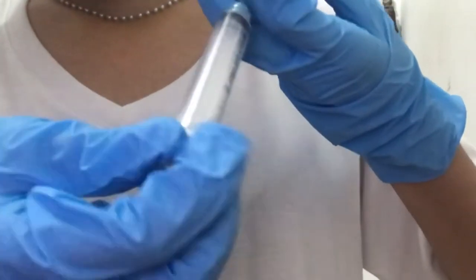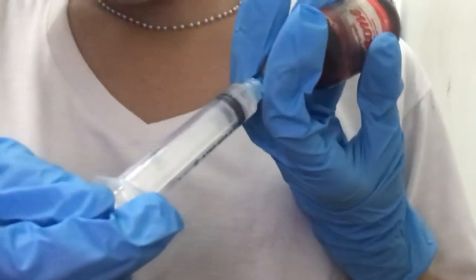Pulling back on the plunger, withdraw the correct amount of medication from the first vial.